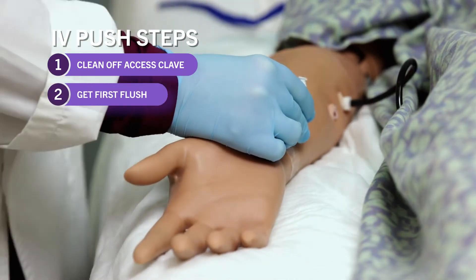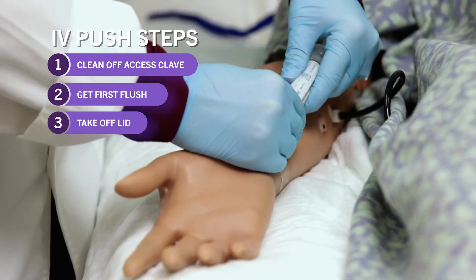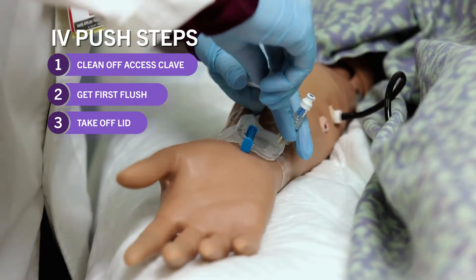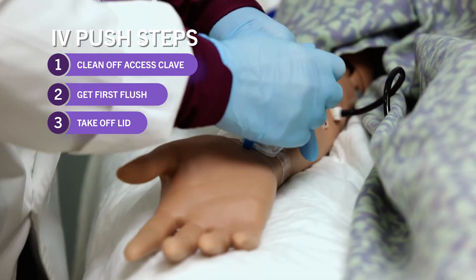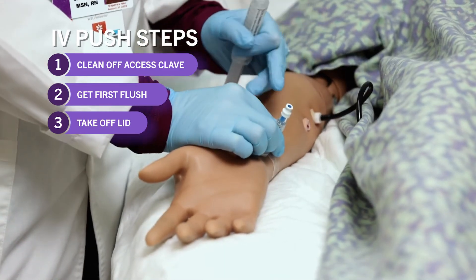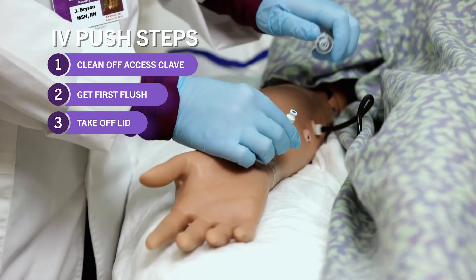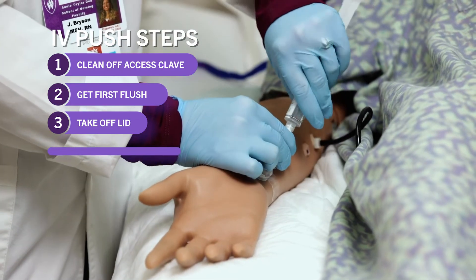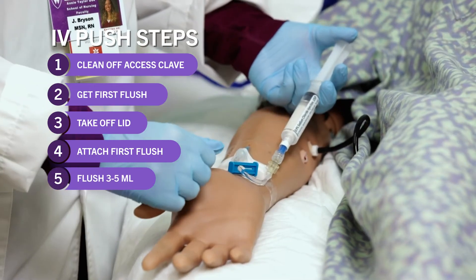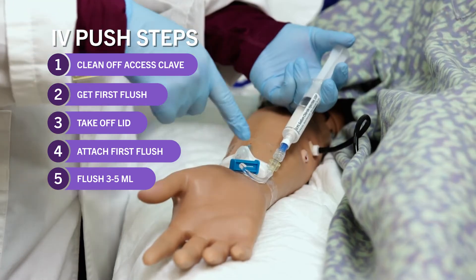Then you want to get your first flush. Take off the lid — it's on nice and tight because this has not been used before. Notice how I'm keeping a hold of the clave. I need to make sure the clave doesn't accidentally touch the patient's skin or the bed, so always keep a hold of that. Attach your flush and flush three to five milliliters to determine patency and clear any medication that could be sitting in the line.